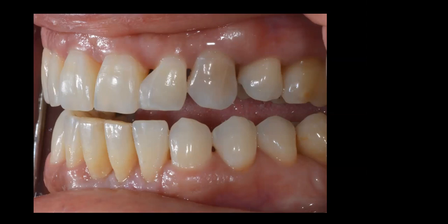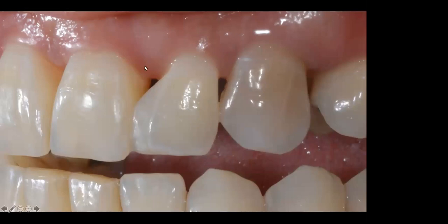So one of the other problems with the shape is that they had to change the emergence profile. So let me ask everyone again. This dentist, when he did the bonding here with his flat mylar, he changed the emergence profile supragingivally.